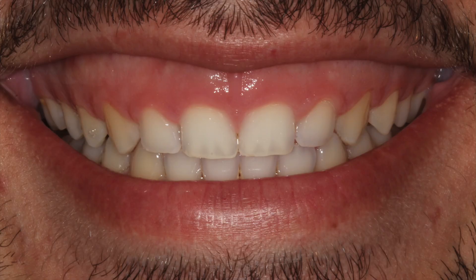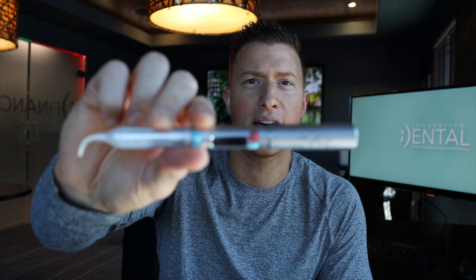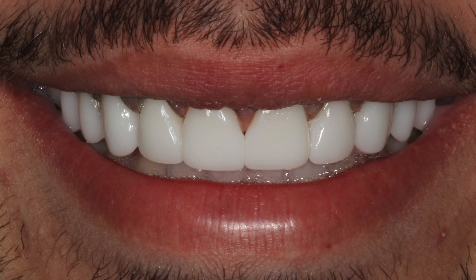You can see in his close-up smile where we haven't contoured the gums yet. So we go ahead and get Manuel numb, then we use this amazing little device, do some veneers — and voila, look at his smile.